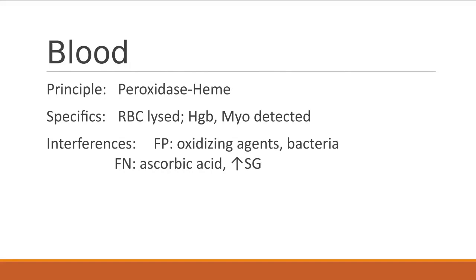It can be kind of cloudy. So urine clarity helps too in identifying between all of them. But you don't necessarily have to see any red blood cells because they're lysed. But you can never have a negative chem strip blood and then see blood under the microscope. It can happen the one way, but not the other. Okay, and that's important to remember.